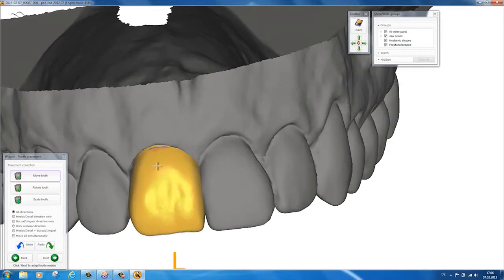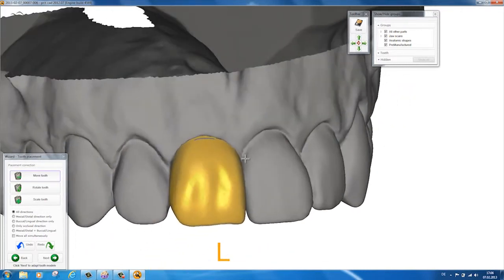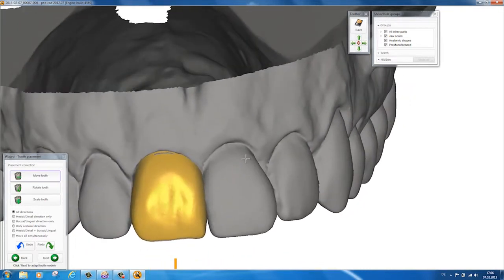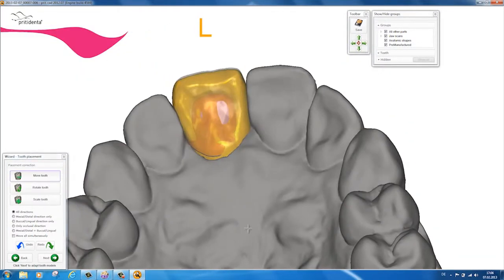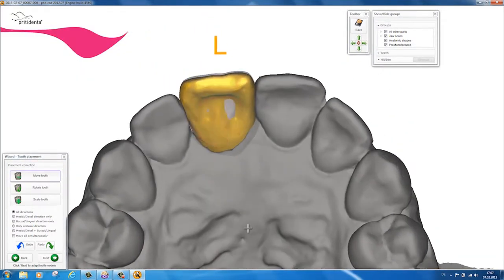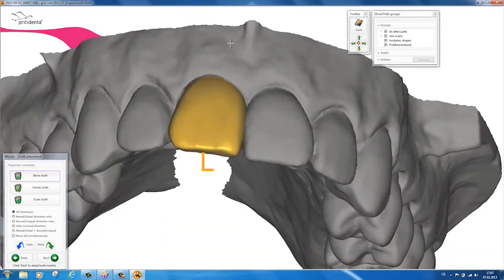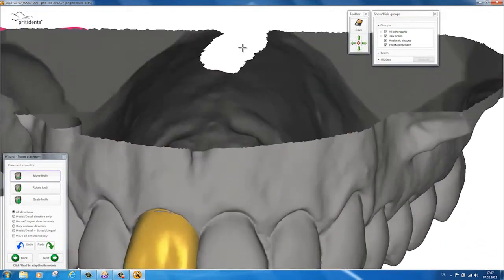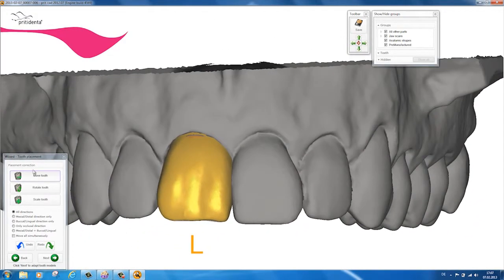In order to obtain an aesthetically pleasing transition from the enamel to the dentin, it is important to get the length of the incisal edge right. To do this, merge in the prefab, align it and launch the calculation.